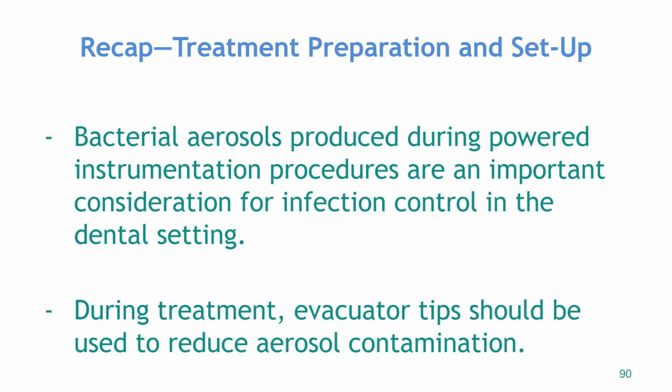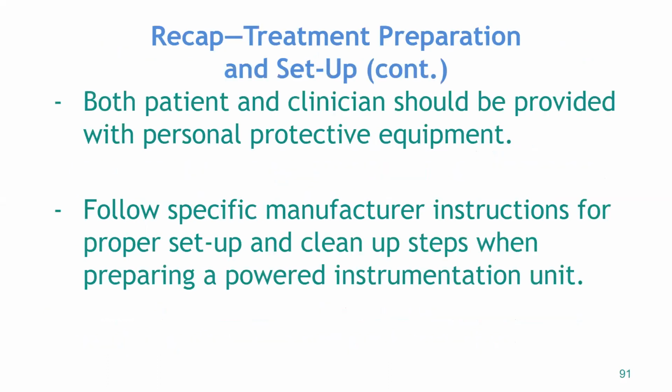Okay, so a little recap here. We talked about how we want to manage our aerosols for the patient you're working on, each other's patients, and then the patients the rest of the day, plus all of us, right? That's how we stay safe. And then during treatment, we should be using high volume evacuation to reduce our aerosols. Both the patient and clinician should be provided with PPE, following specific manufacturer instructions, proper setup, and cleanup steps when preparing a power instrumentation unit.